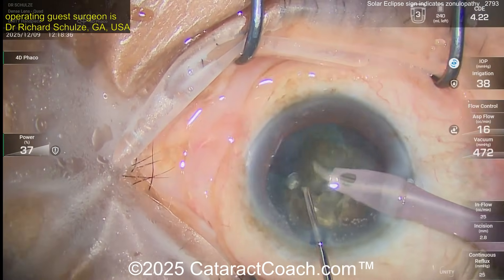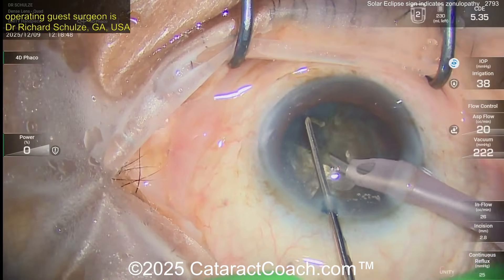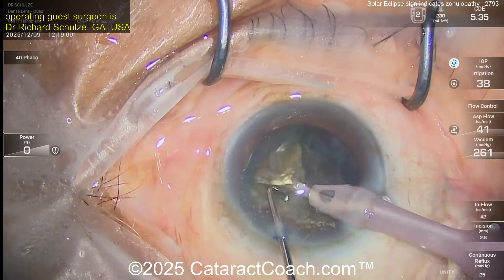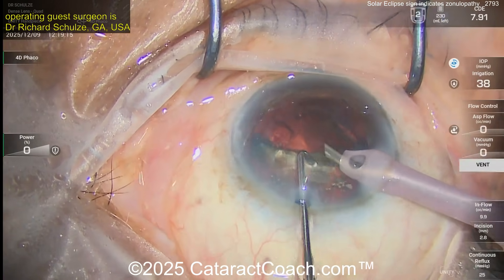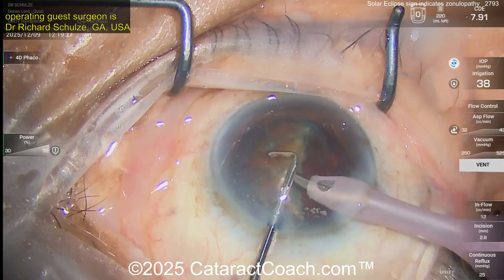The CTR keeps the capsular bag equator open and basically expands the bag as you remove the nucleus. It pushes outward on the equator of the capsular bag, so even when you empty the bag by removing the cataract you have support in that area. That was a very smart move — putting the CTR in early is going to make life a lot easier. With a brunescent or dense cataract like this there's not much cortex, so you don't have to worry about trapped cortex.